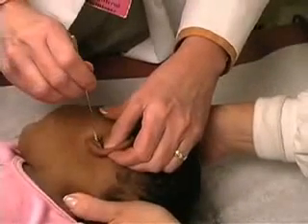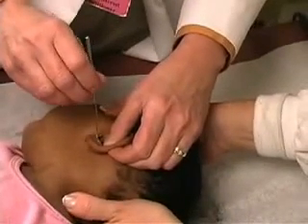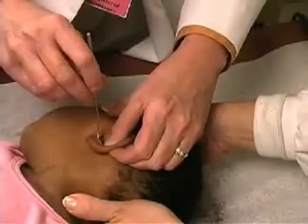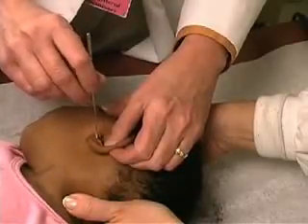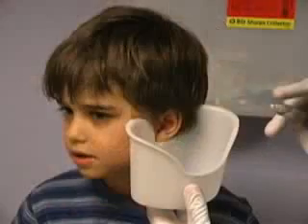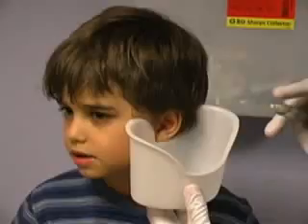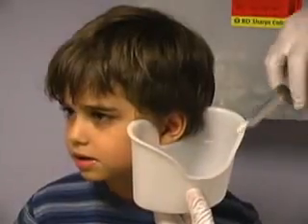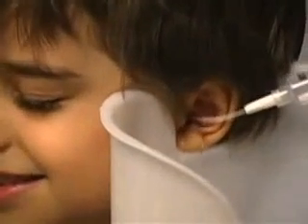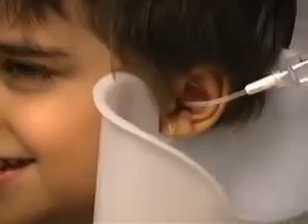If small amounts of cerumen still remain, insert the triangular applicator wrapped in cotton approximately 0.5 centimeters in the canal. Twist the applicator while withdrawing it from the canal. Alternatively, you may use an irrigation technique. Obtain a large syringe filled with lukewarm water connected to butterfly tubing to flush out the cerumen. Use of cold water should be avoided, as it is uncomfortable and may cause nystagmus.